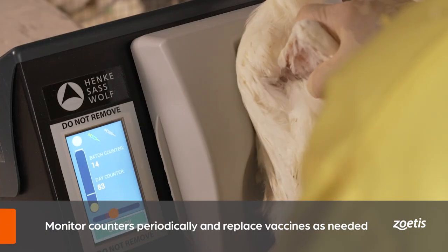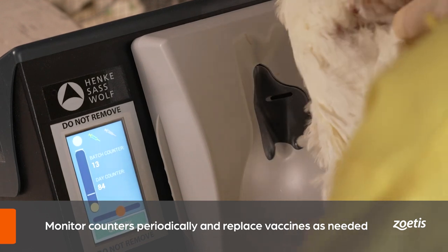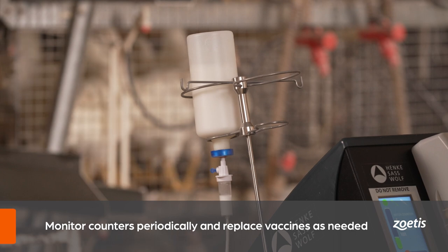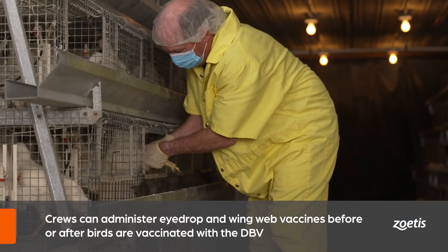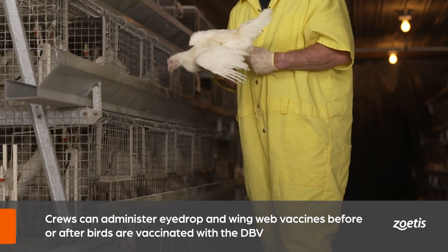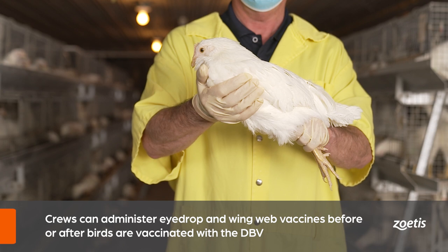After vaccination is complete, make sure to separate vaccinated from non-vaccinated birds. Repeat this process until all birds are vaccinated. Periodically monitor the vaccination count on the device, the volume of vaccine remaining, and the volume remaining in the bottle. Replace vaccines and needles as needed. Note that other vaccines, such as those administered by eyedrop or wing web, may be given before or after birds are vaccinated with the DBV.